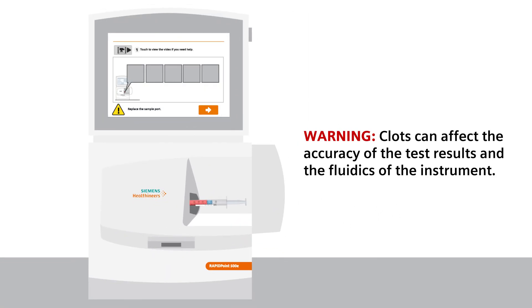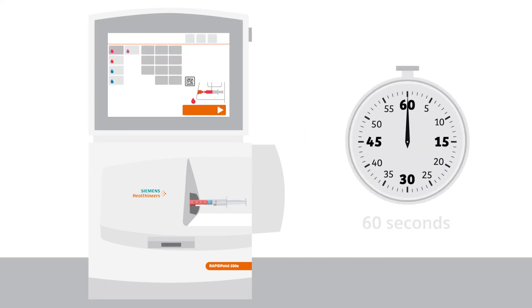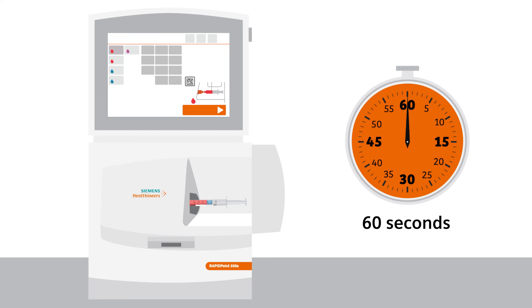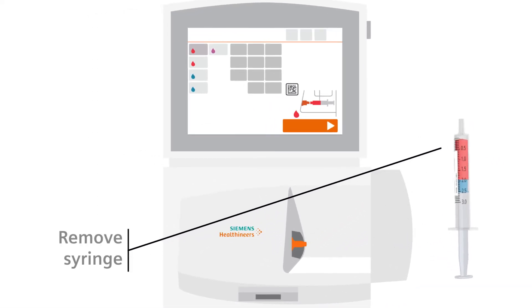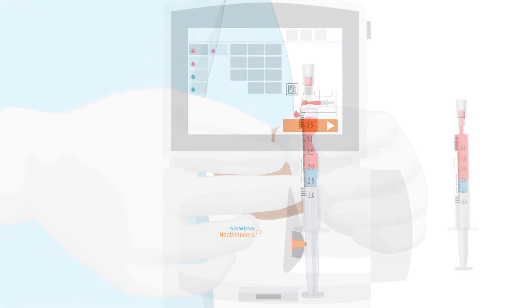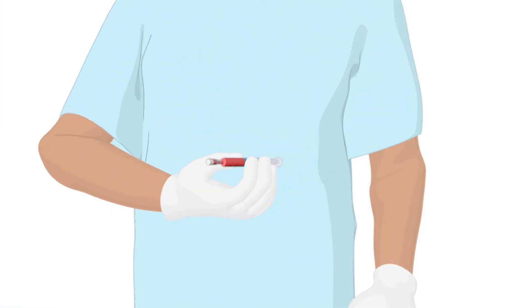Recognize that a sample containing blood clots should not be used on the blood gas analyzer because it can affect not only the accuracy of the patient results, but also negatively impact the operation of the blood gas analyzer. The patient's blood gas results will be ready within 60 seconds. Remove the syringe from the analyzer, reattach the filter cap, and debubble the sample. If you need to repeat the test, remix the sample prior to analysis.